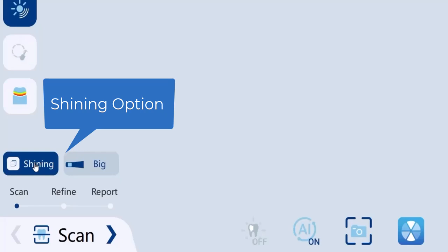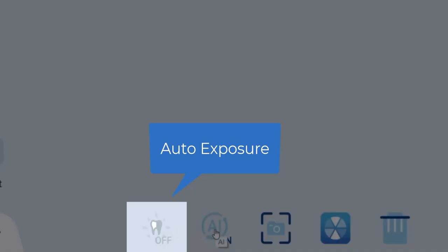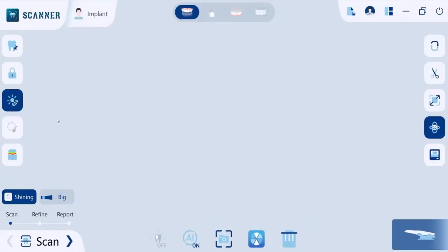Also, anti-shining here will allow enhancing scanning of shining objects like metal restorations or scan bodies. Auto exposure automatically adjusts the intensity of the light according to the different clinic environments and the degree of reflection of different scanning targets during scanning.